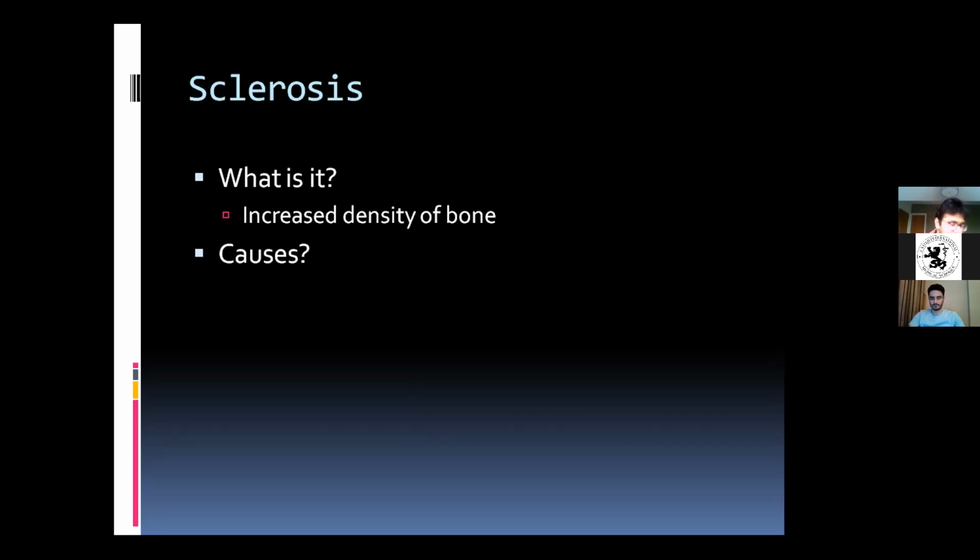Okay. What are the other things? What else can cause sclerosis? Mets, exactly. And they're specifically osteoblastic Mets. Not very common. Yes, there are several malignancies that can cause osteoblastic Mets, but they are very rare and they'd rather cause osteolytic Mets instead. What else? Think about other bone pathologies. We've said osteomyelitis, that's a type of inflammation.